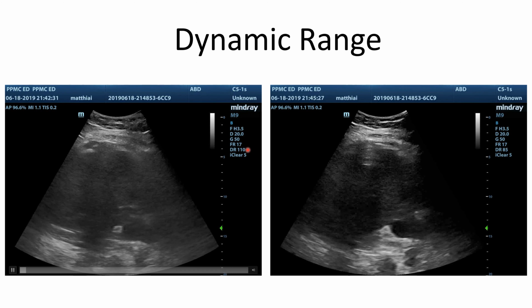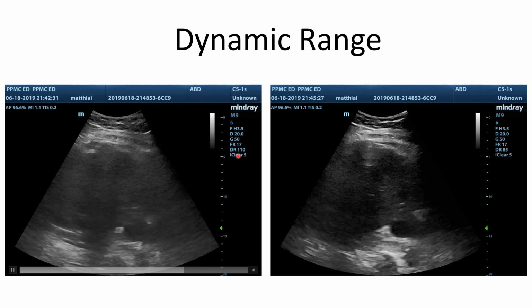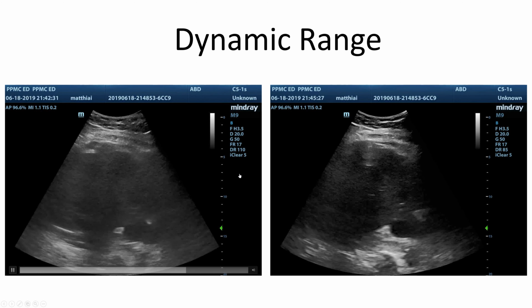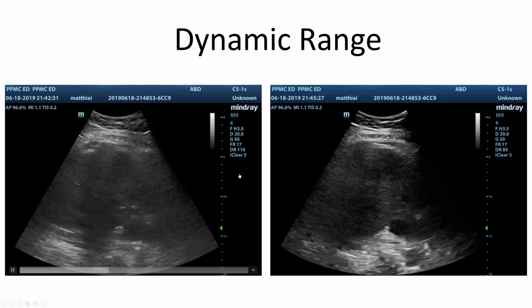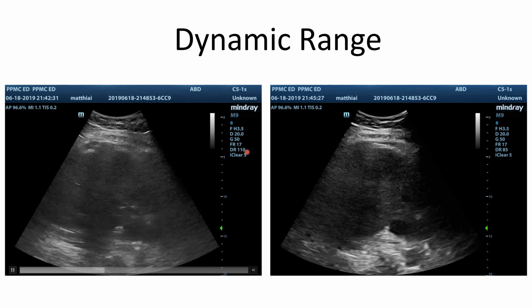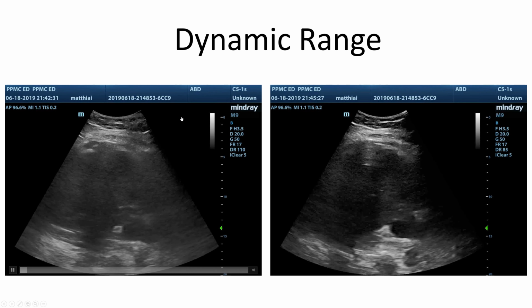On a Sonosite, it might not be displayed in the settings area, but it will start with a dynamic range of 0, and you can crank it up to +3 or down to -3, and that will have the same effect as on our fancy Mindray machine of turning the dynamic range number to a lower decibel number.